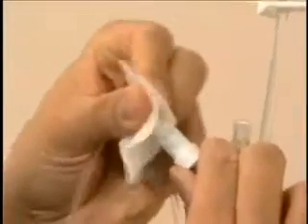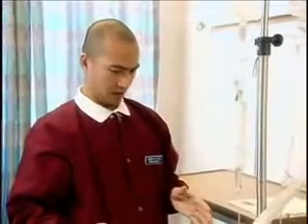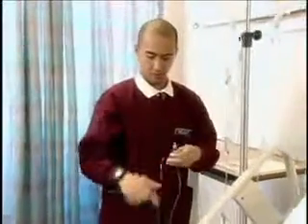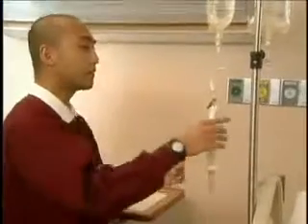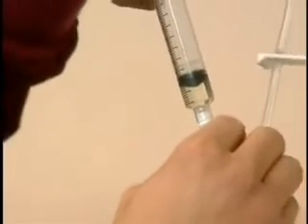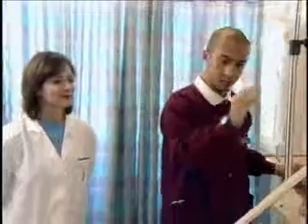Oh, very good, dear. I am impressed. Thank you. Now it's time to remove the cap from the medication. That's right. Let me put this down. Insert the syringe into the port and inject the medication into the chamber. All right. And then you agitate the volume control chamber to mix the IV solution with the medication.